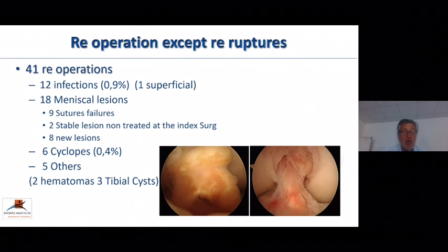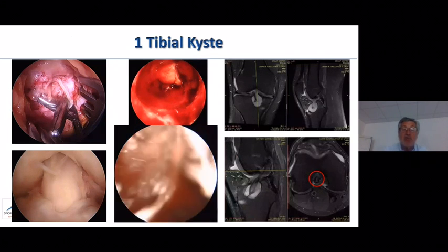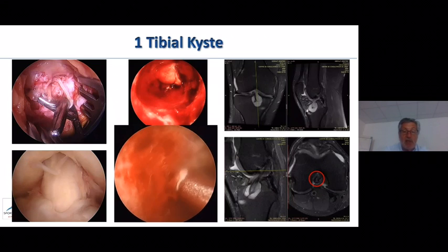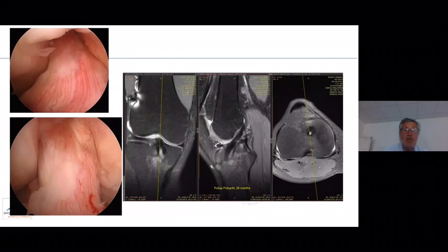We also had free hematoma and free tibial cyst. That is an example of a tibial cyst, only 3 among the cohort. And you see the intra-articular view, and a good graft. And after removing the cyst, I did a bone graft of the tibia, and everything returned to normal condition.